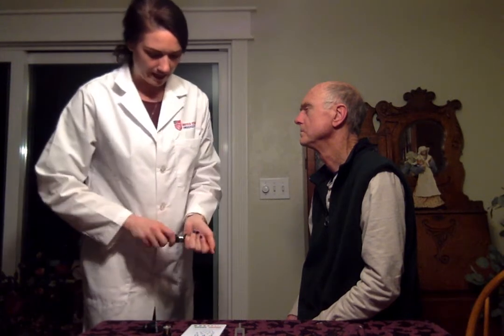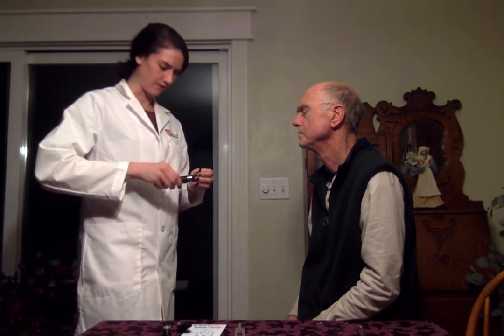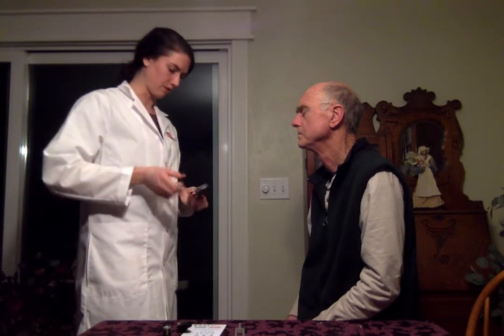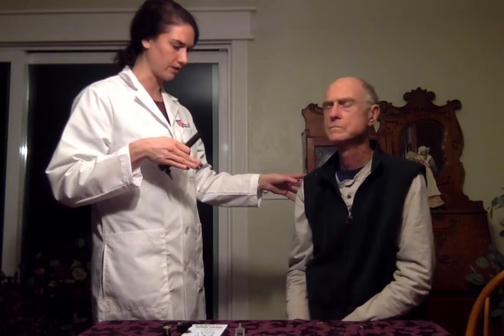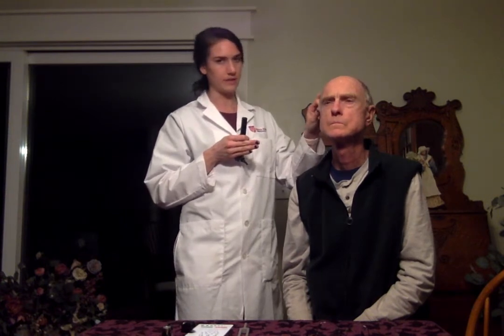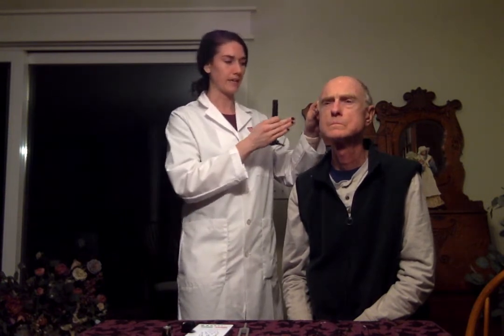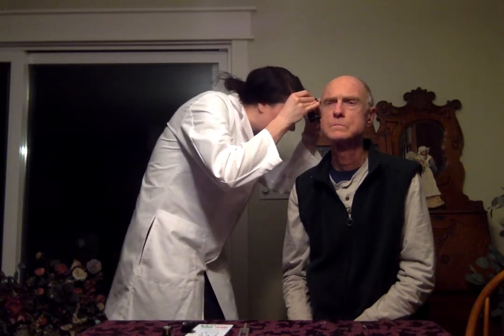I'm going to go ahead and look inside of his ears with a clean tip. And for safety purposes, I'm going to leave it upside down so that I can have something to help. And I'll have him turn towards the camera so you can see that as I go in, I'm going to be going in this way. So I'm also going to pull on his ear upwards so that it makes the ear canal straighter so I can see. And what I'm going to be looking for is the tympanic membrane.